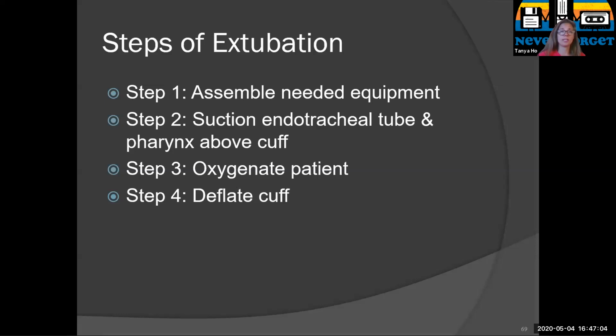Okay, so assembling the needed equipment, I'm going to get more suction equipment ready. I'm going to get whatever oxygen device I'm going to put them on, ideally with some humidification after, and re-intubation equipment if it's needed, or if I anticipate them needing to be re-intubated. You never really know, so it's not a bad idea to have intubation equipment ready in the event that things go bad.